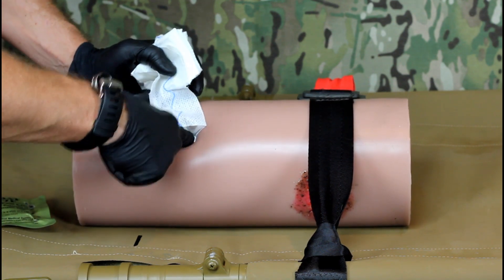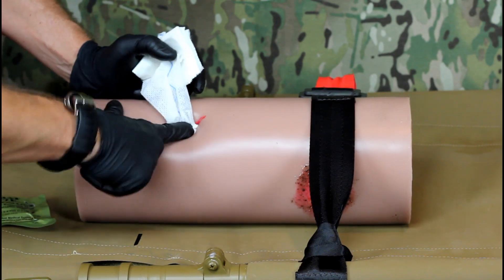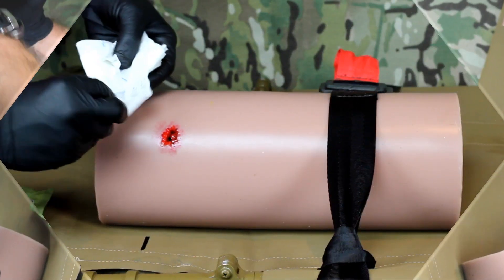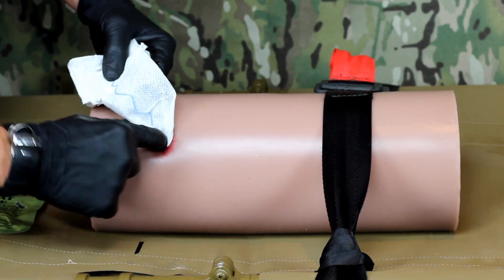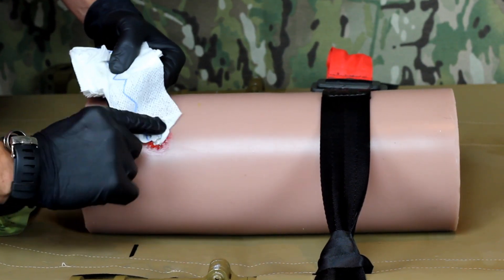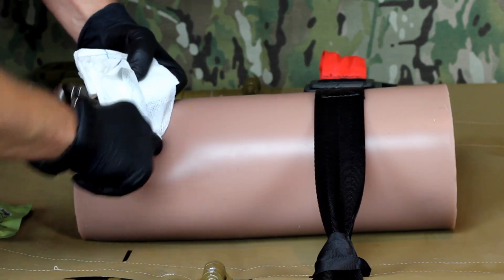Start at the source of bleeding and work outward, packing the space tightly with the gauze as you go. Small caliber gunshot wounds and small shrapnel wounds can be very challenging. It is vital that you get combat gauze into the wound and into contact with the source of bleeding.